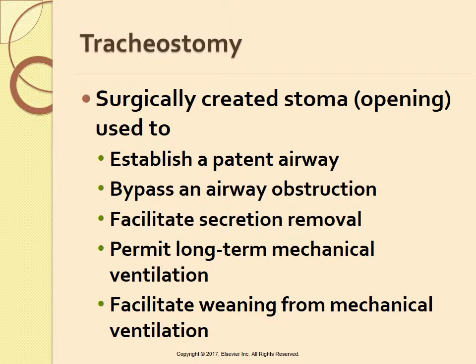A minimally invasive percutaneous tracheostomy can also be performed at the bedside using a local anesthesia and some sedation or analgesia. A needle is placed into the trachea, followed by a guide wire. The opening is progressively dilated until it is large enough for insertion of the tracheostomy tube.